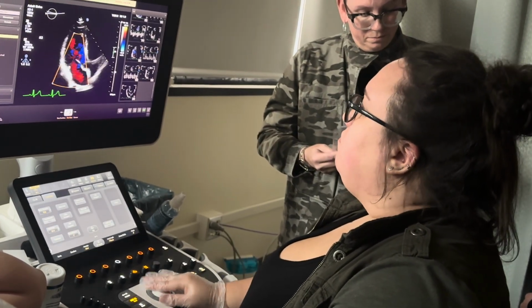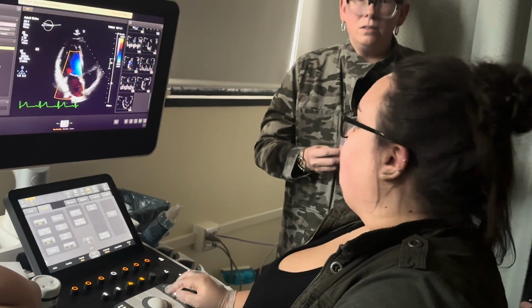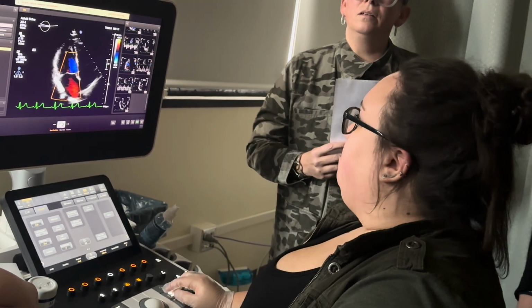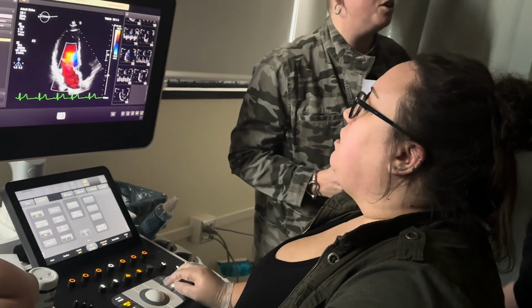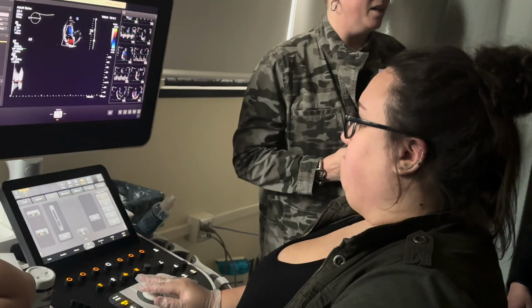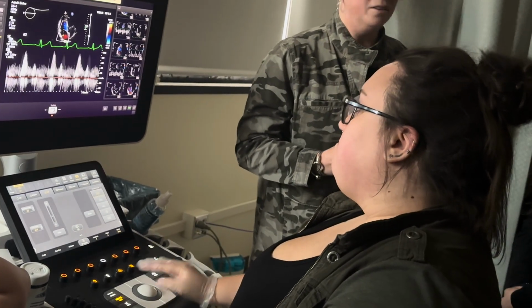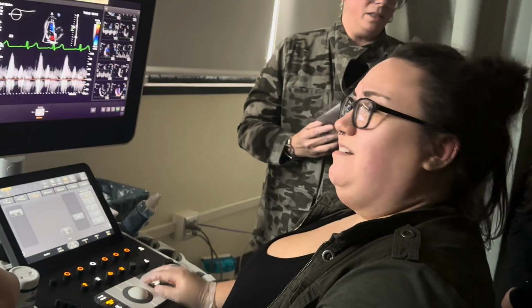This one is 40 minutes also. But we're not measuring on this one. We are just showing you measurements because that's coming up on the proficiency at the end. We're trying to show you ahead of time so you can practice them. How much time on the proficiency do we get? I think it's an hour.